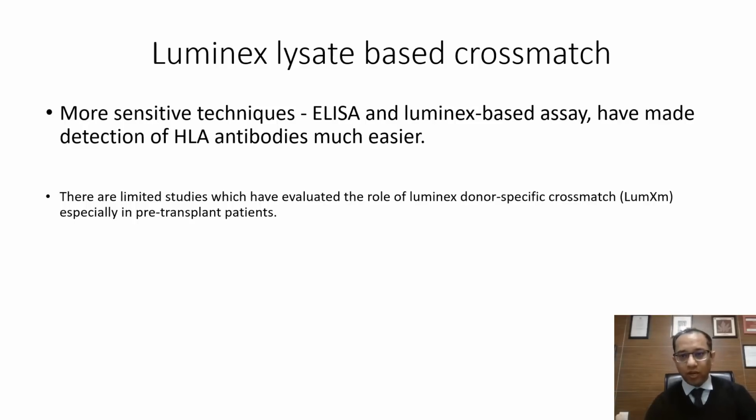You are using a Luminex based assay, and this has made the detection of HLA antibody very, very clear. But not many studies have been done on this Luminex lysate based crossmatch test. And why is that? It is because there are some limitations present in this test which we need to know before we start employing it in our algorithm for pre-transplant testing.